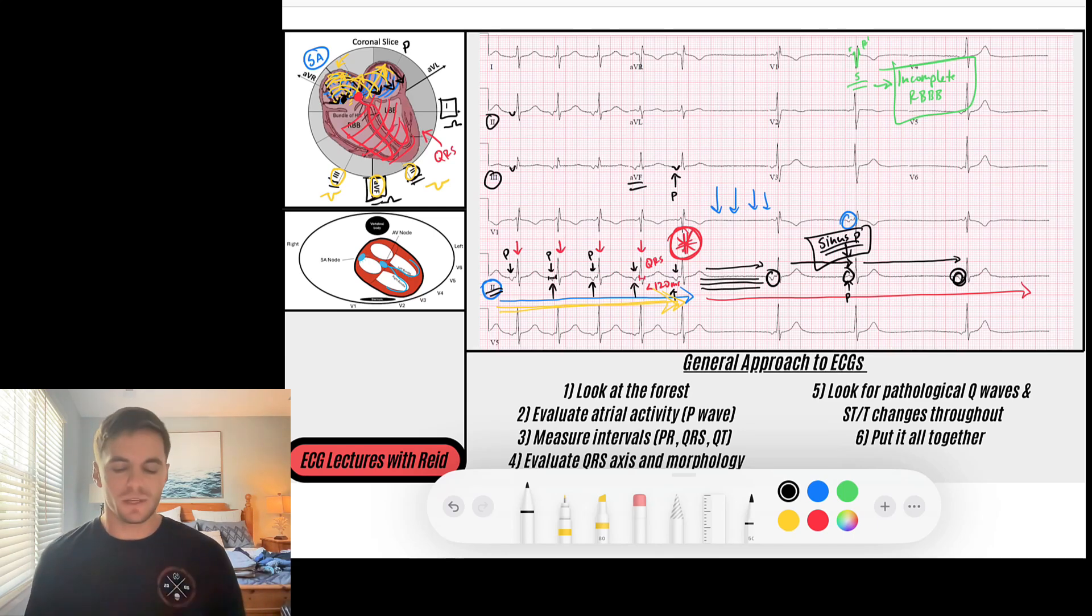Sinus P waves, as we defined in blue earlier on the video, are going to be upright in leads one and AVF as they head down to the left, because that sinus node sits high in the right atria. On the other hand, an ectopic atrial rhythm that is driven by a focus within the atria and an ectopic origin is going to create a wave of depolarization that is different, and you need to look at that in all the leads.